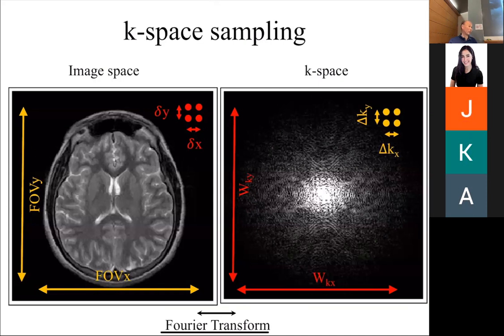That's what's called the slew rate. Every gradient comes with a slew rate, which tells you how fast it can go. So there's a hardware limitation, but you can actually buy gradients that are super powerful that you can't use. The reason is that if I have a time-varying magnetic field and I switch it really quickly, guess what? I have E equals minus dB/dt. That generates currents in the body, and that can be quite painful.